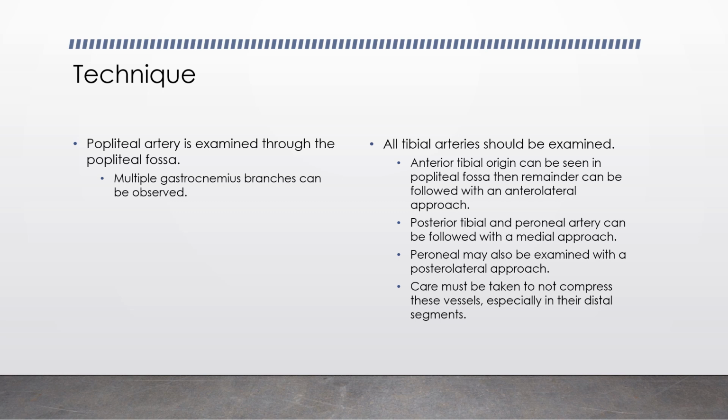Then we're going to look at our posterior tibials. Those are going to follow our medial calf. So it would be from that medial malleolus deep into the calf, deep into the posterior calf. And then our peroneals are going to be deep in the calf, posterior to our posterior tibs.